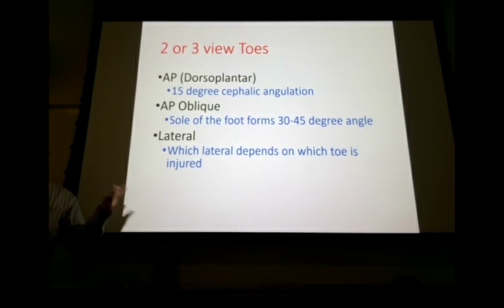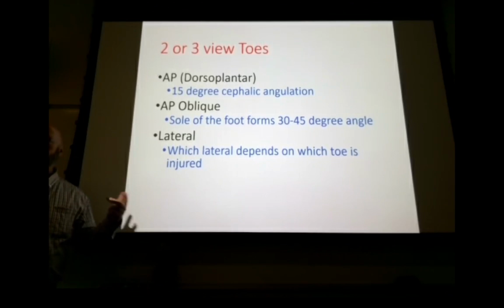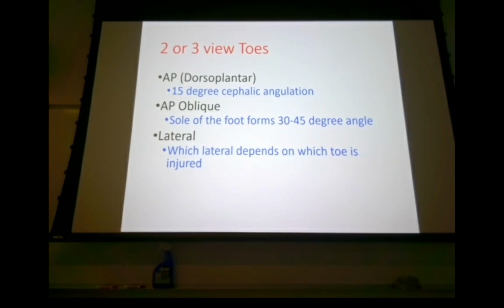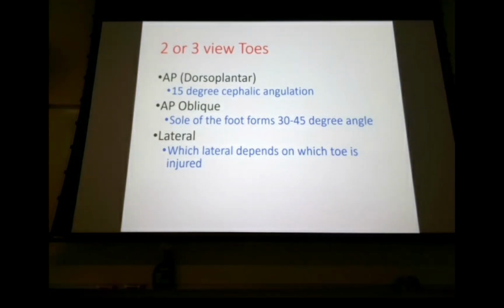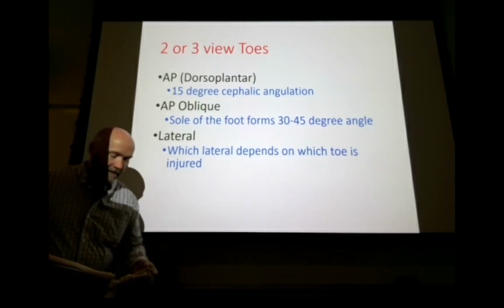You may run into some questions that ask which lateral consistently provides the best lateral projection or visualization. The answer is kind of counterintuitive, and it's opposite of what you almost always do. And this is just a test thing.